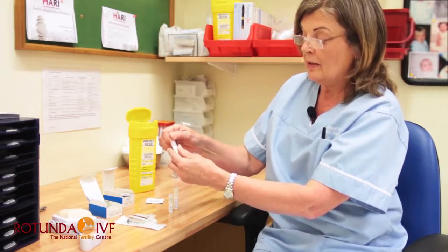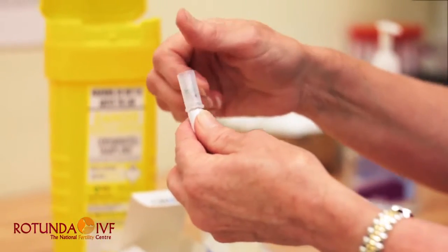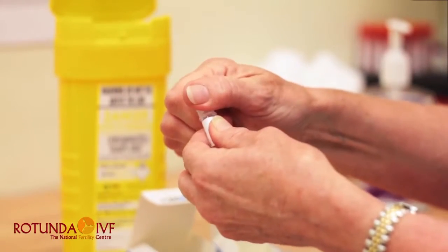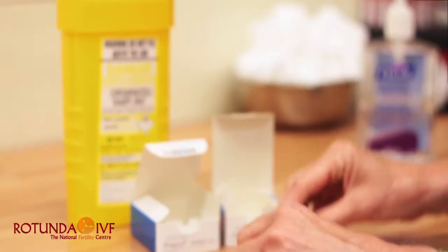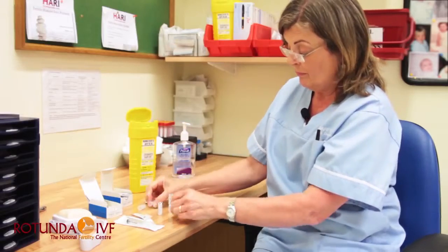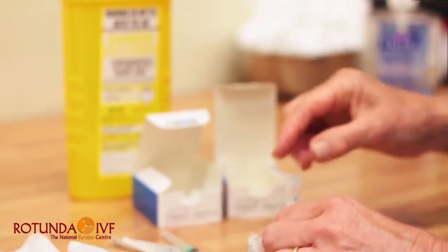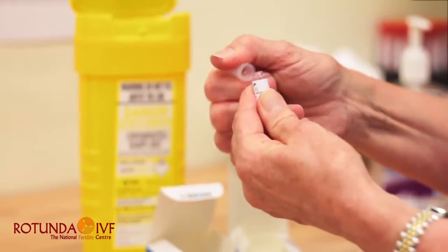Again, hold the base of the ampoule in your left hand and with your right thumb covering the black dot, snap the top of the ampoule off. With your second powder, repeat that. And the vial of fluid, again, put your thumb over the black circle and break it off.